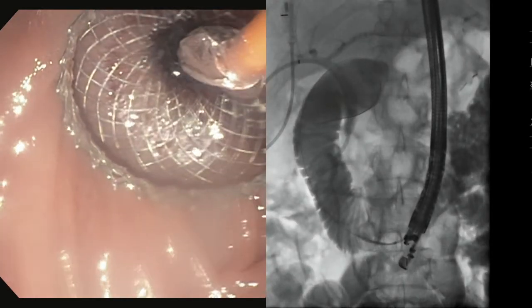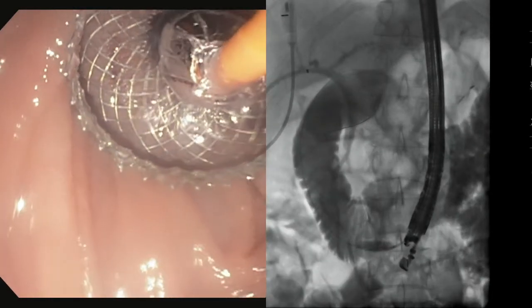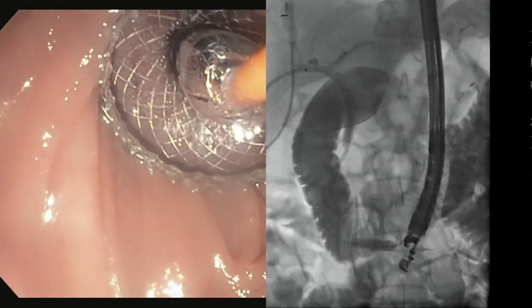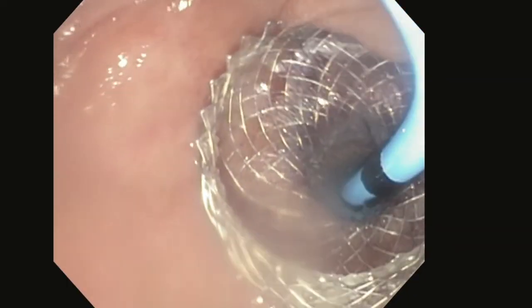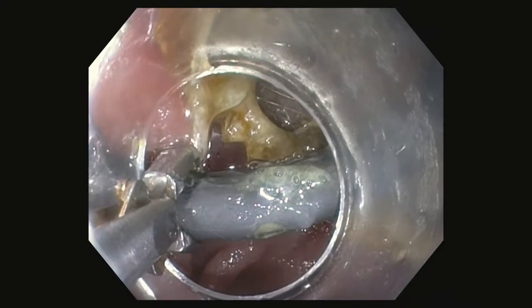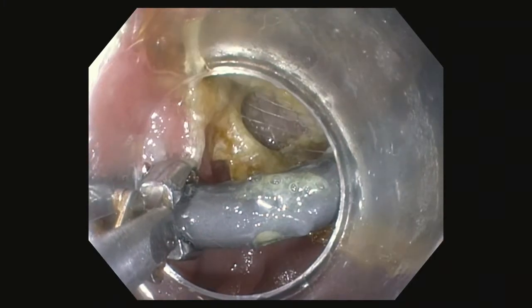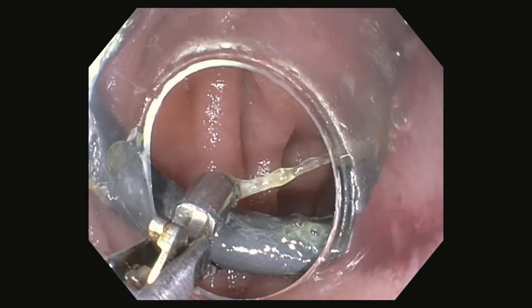The LAMS was dilated using an 8-millimeter balloon dilator. A 10 French by 3-centimeter double pigtail plastic stent was then placed across the LAMS. Six weeks following anastomosis creation, the patient presented for trans-jejunal ERCP.